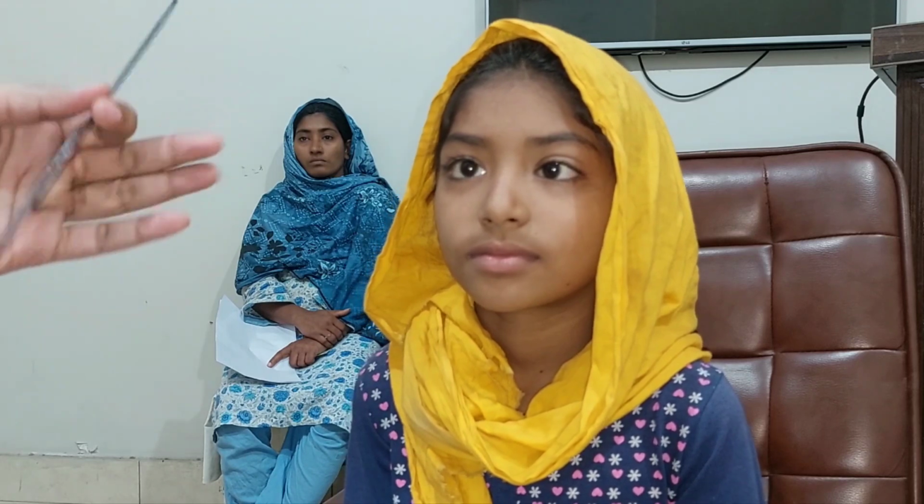I would like to do the alternate cover test. No, keep in mind, on the cover uncover test, what information have you gathered? Is it alternate squint or is it unilateral squint? It is not alternating. If you cover the right eye, the left eye takes up the fixation. But when you remove the cover, then again the right eye takes the fixation. Had the left eye been fixing continuously, then it would have been alternating. So this is a unilateral squint. The left eye is continuously deviating on uncovering also.